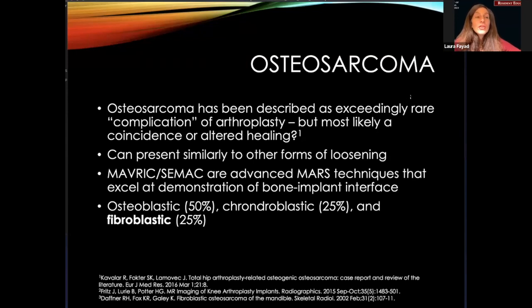So there's a good question in the chat. Do you do MRI routinely for suspected implant loosening? It depends on your institution. In my fellowship, as Dr. Fayad can attest to, we did routinely do MRI for loosening. In my institution, and actually what the ACR appropriateness criteria still say, is CT and bone scan. I think that's because of the wider availability of that.